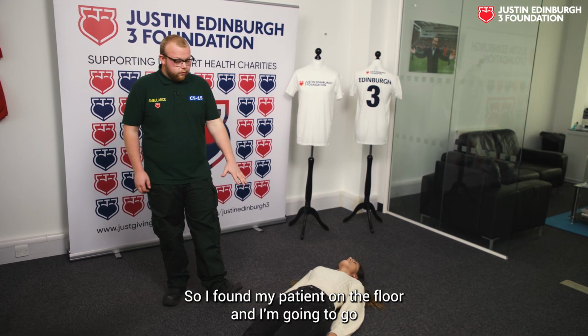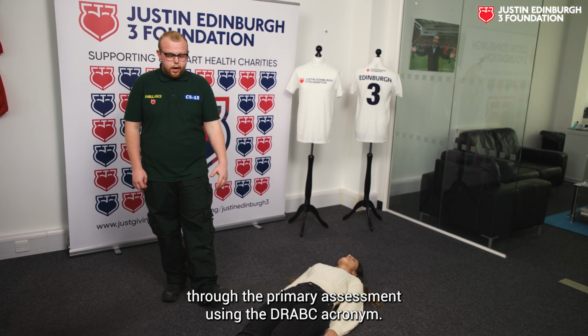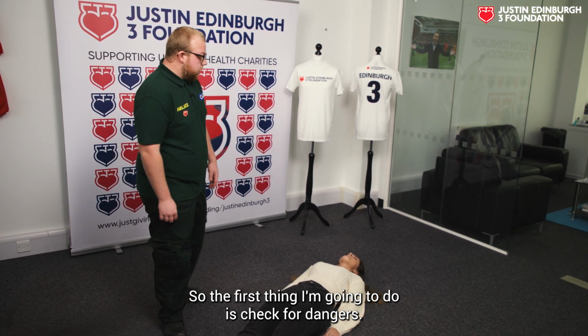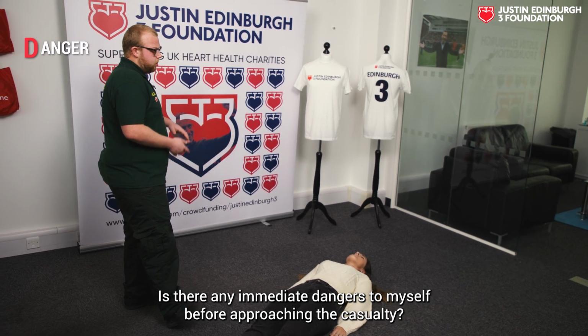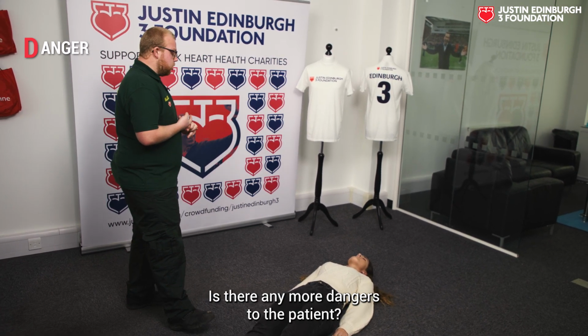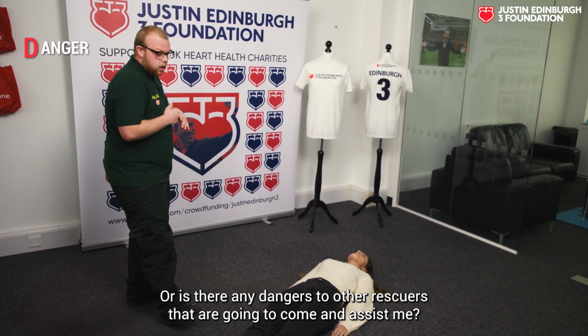So I found my patient on the floor and I'm going to go through the primary assessment using the Dr. ABC acronym. The first thing I'm going to do is check for dangers. Are there any immediate dangers to myself before approaching the casualty? Are there any more dangers to the patient? Or any dangers to other rescuers that are going to come and assist me?